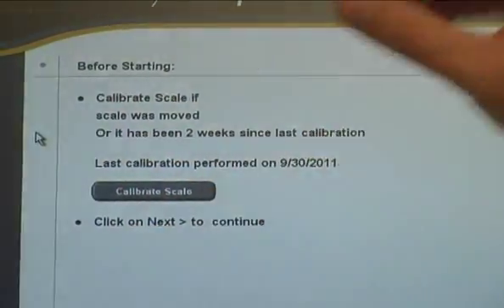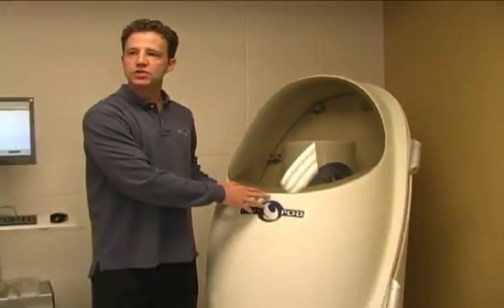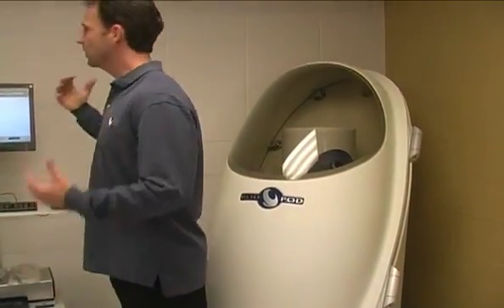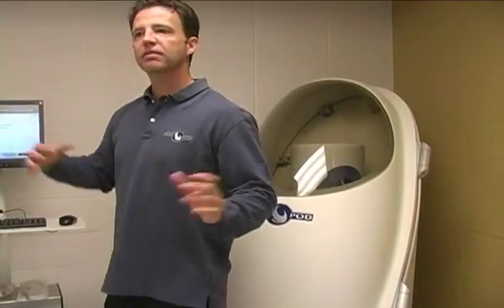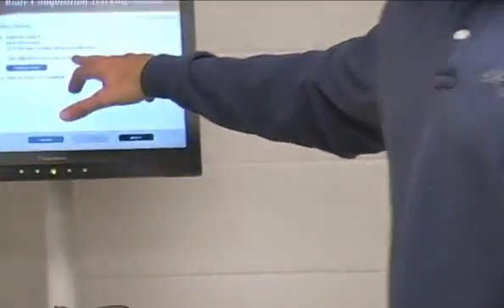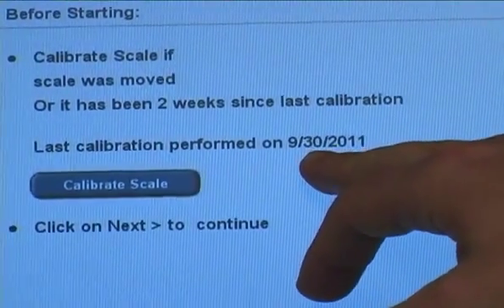It talks about calibrating the scale. This is part of the measurement. This is a body composition system like hydrostatic weighing. We get your mass on the scale. The only difference is volume is derived from air displacement rather than water. So it's incumbent that this is accurate because it's basically half the test. This shows the date you last performed the calibration, which was today. I performed it this morning.